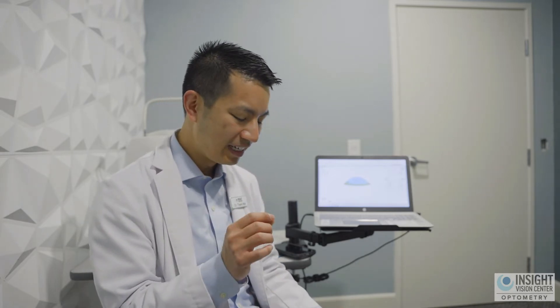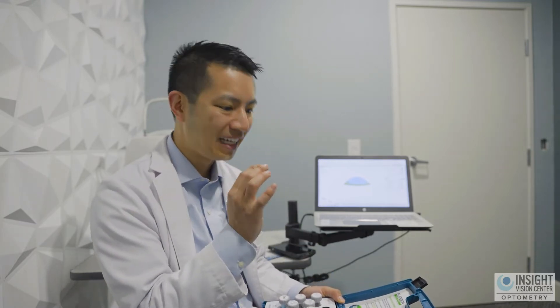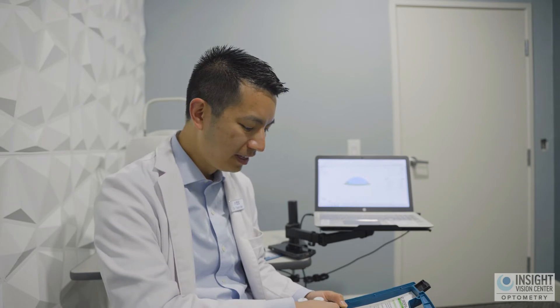When you put on these trial fitting lenses, your vision is not perfect because they're not necessarily made for you — they just give the doctor a rough ballpark to determine the prescription afterwards. You'll take one of these trial lenses, put it on the eye at that visit, and then we'll test your vision through the phoropter.